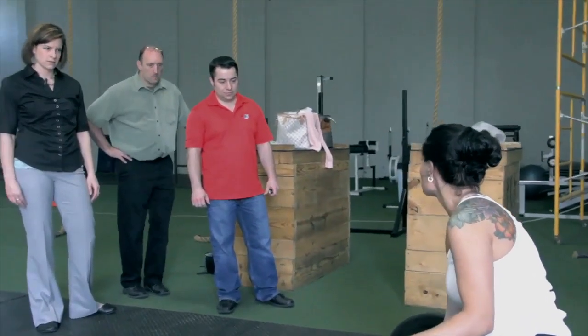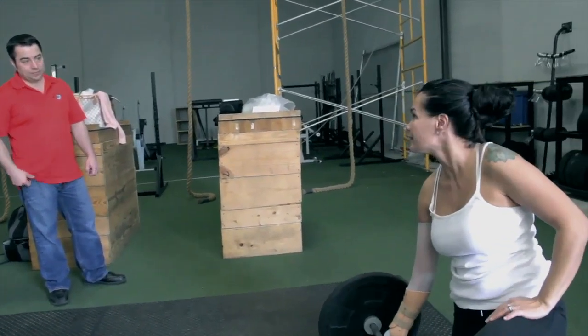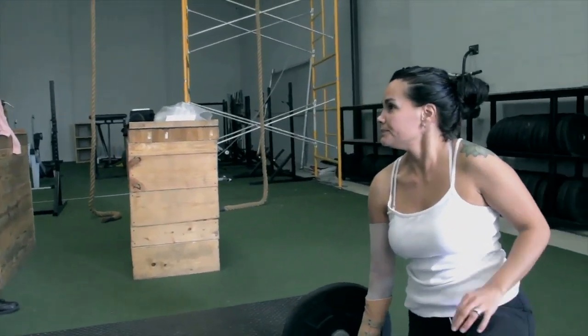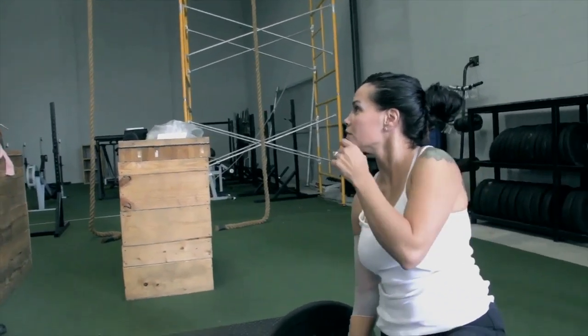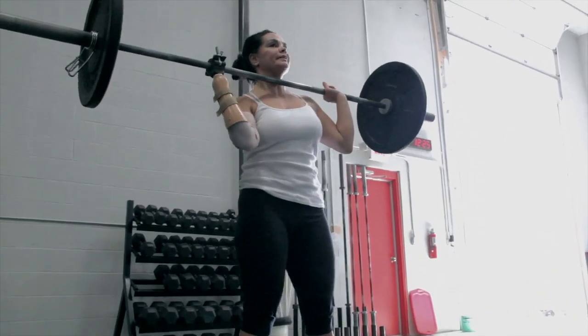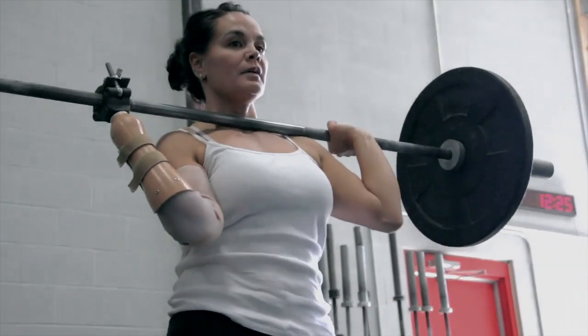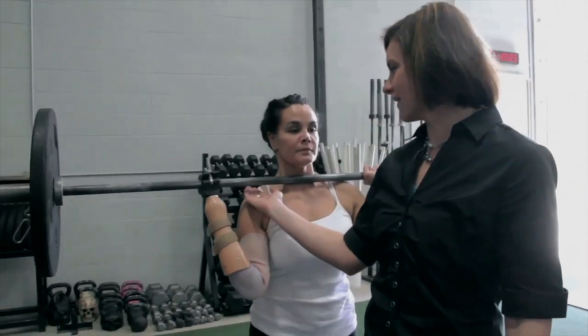When I try to do a snatch with a bar and hold it overhead, I can't — because I have no... rotation. Wrist extension. The wrist would tilt back just a little bit and align her.